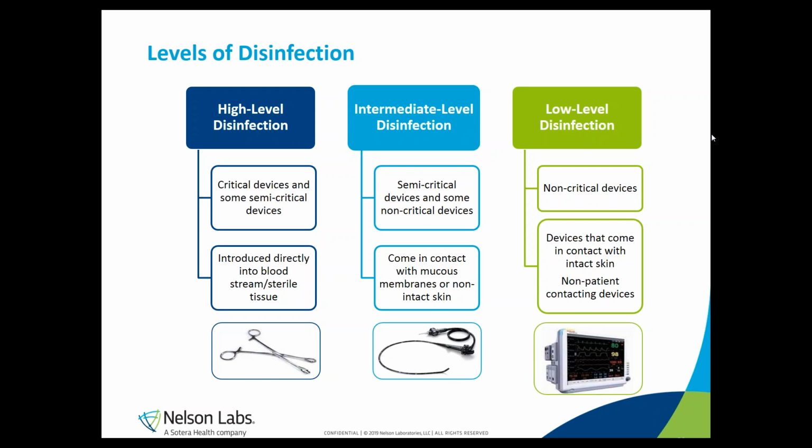A monitor, for example, has no direct patient contact, but can be categorized as a non-critical device. So for a monitor, cleaning followed by a low-level disinfection procedure may be sufficient.